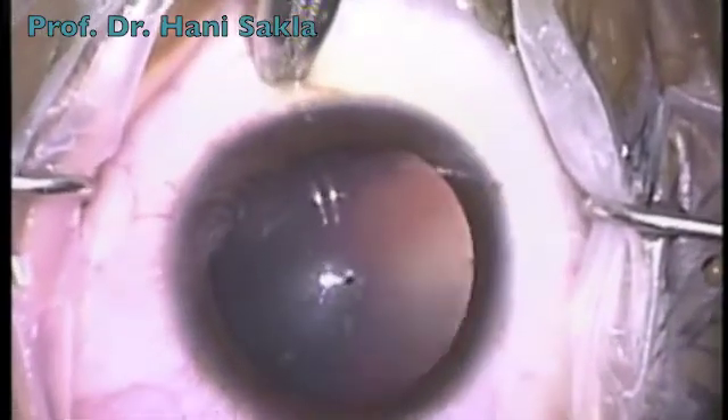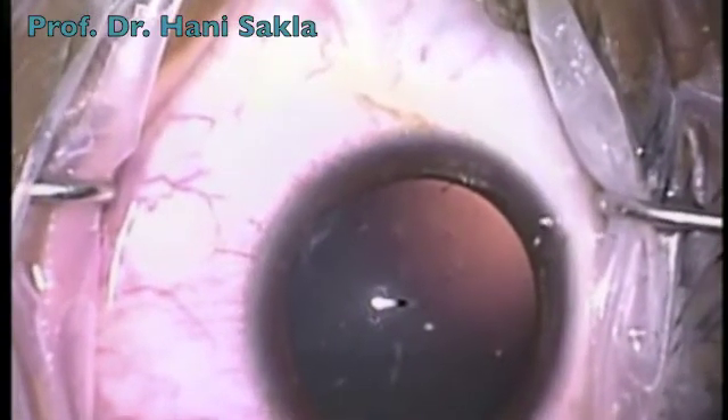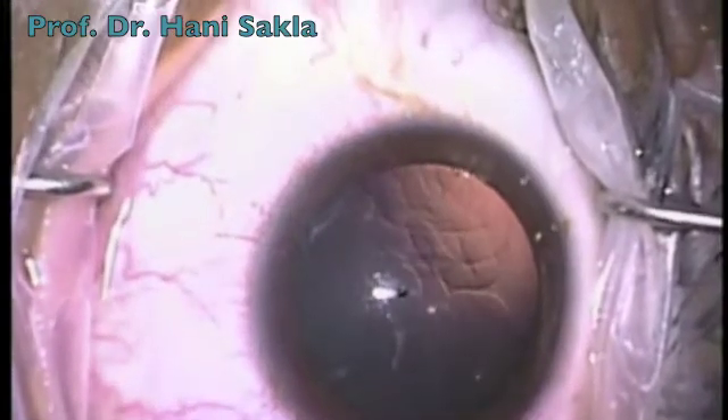We make a clear cornea incision of about 3 mm. We fill the anterior chamber with a low viscosity viscoelastic like the Microvisc or the Provisc.